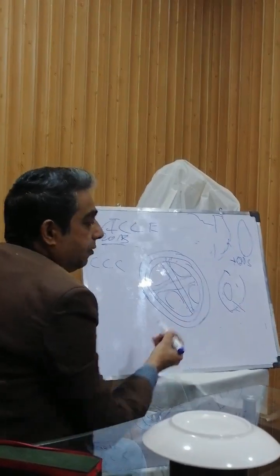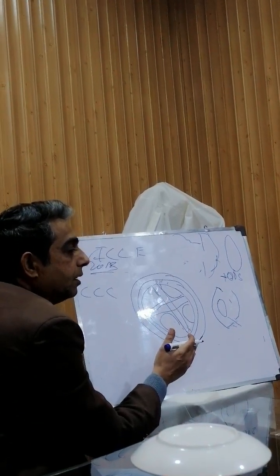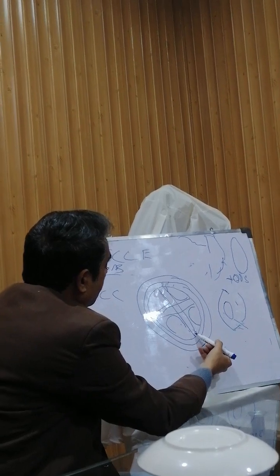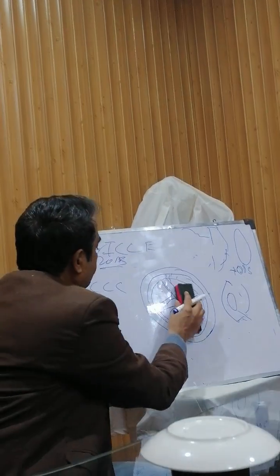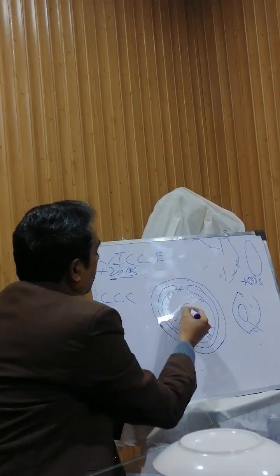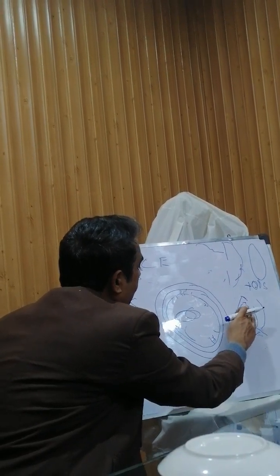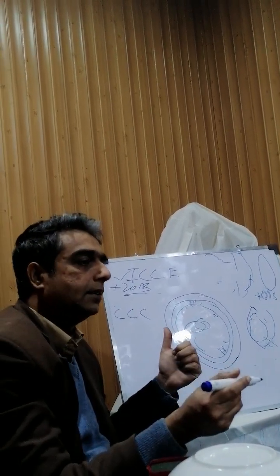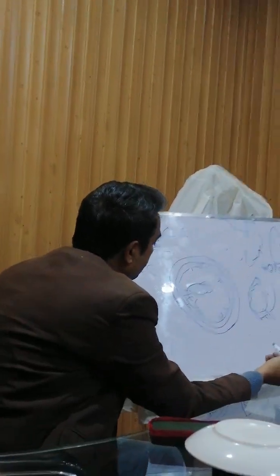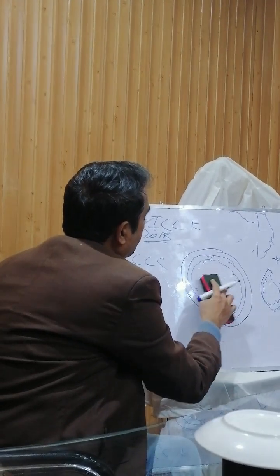Now we switch to the third step, where the phaco power is decreased, because now we have cut the nucleus with the ultrasonic probe, and now we just need to aspirate. So with less power, with the phaco probe inside, we first of all remove one, second, third, fourth, ultimately all of the four parts of the nucleus, and now we are left with only cortex. Between the anterior capsule and the nucleus is the cortex. Nucleus is gone, and we are left with the cortex. With the two-way cannula, one end is a syringe, and the other end is the suction cannula. You take out the phaco probe, and you enter with the two-way cannula, and you remove the cortex. Now you are left with just the posterior capsule.